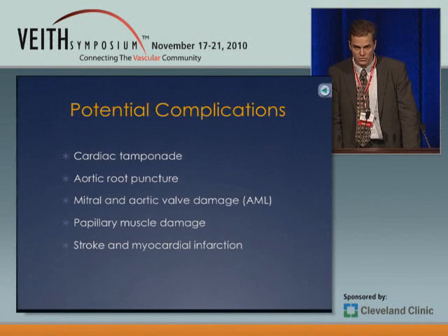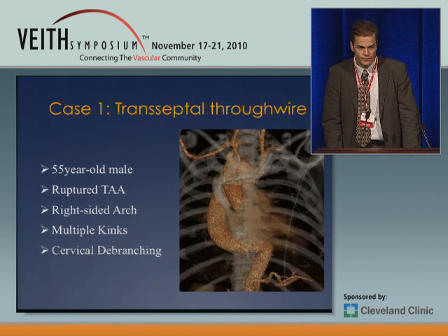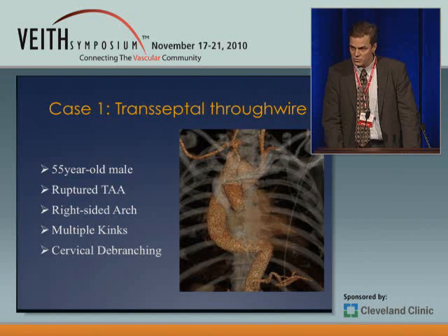Complications: most dangerous is of course cardiac tamponade that requires immediate action. Contraindications: left atrial thrombus, endocarditis. And I'd like to share 2 cases with you where we used this access.